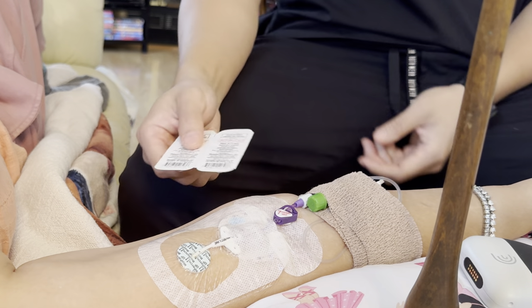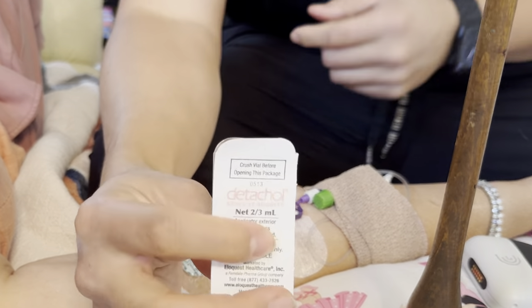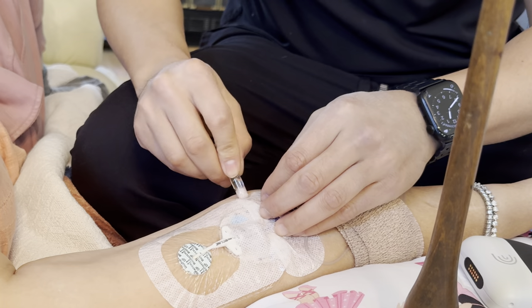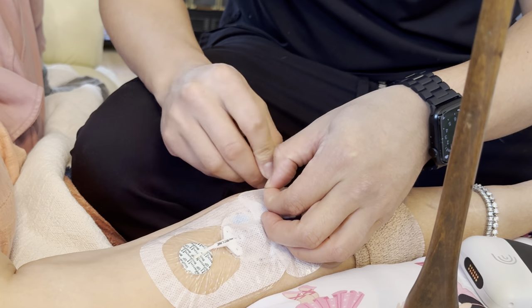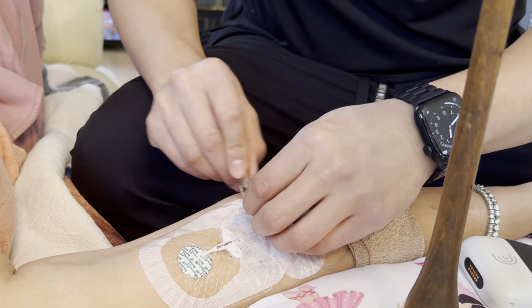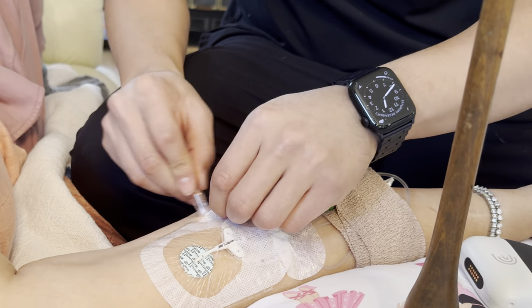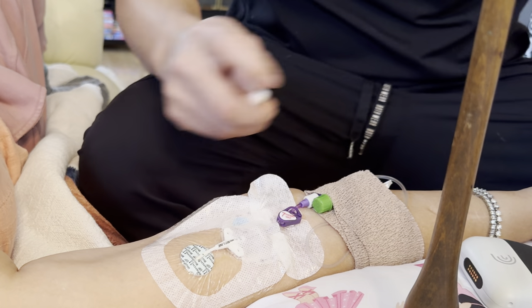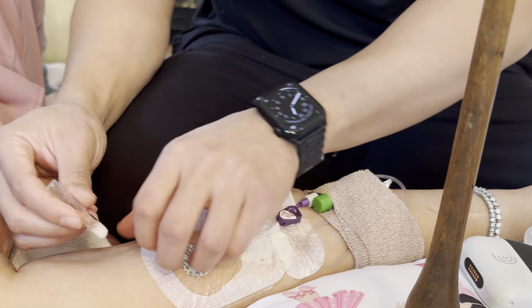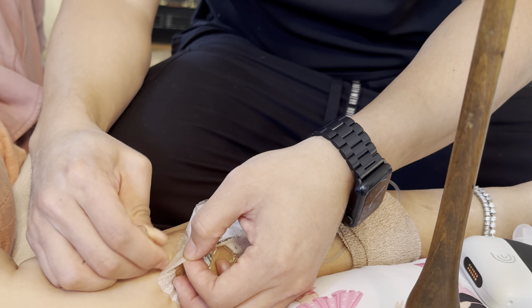We have the detach-all today, so we're going to remove this. With detach-alls, you want to crack the vial in the casing, in the packaging. Slowly — no pain, right? Does it hurt when they take it off at the hospital? Yeah, this is some magic. Detach-all is really good for removing all adhesives. Another way is to take saline and get underneath. They do have much bigger vials, although I have yet to get a hold of some — hint hint, if I can get those longer vials.